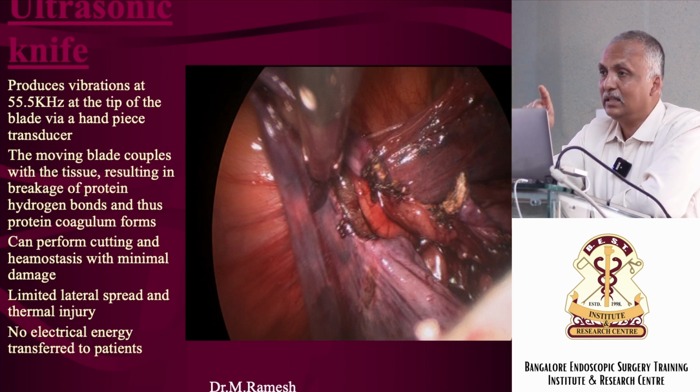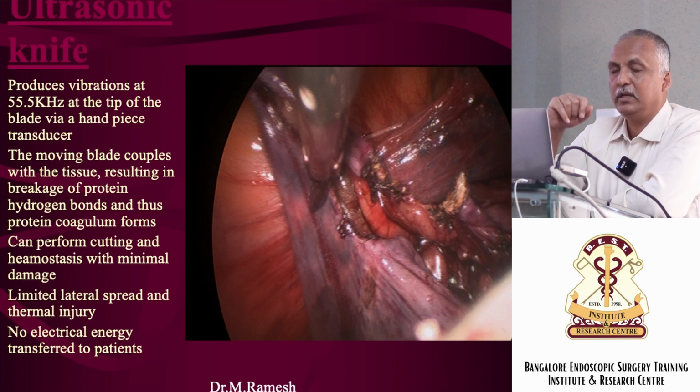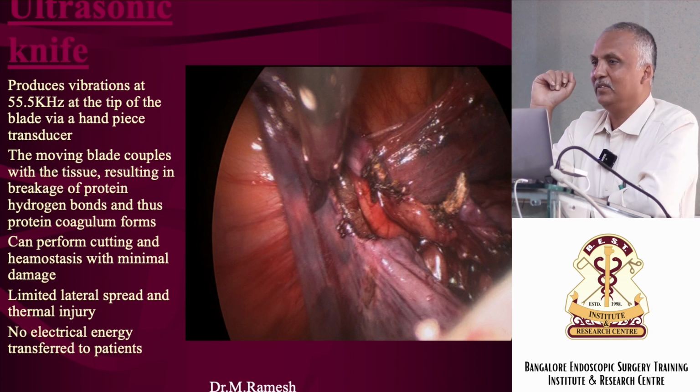But there is something called lateral thermal effect. When you are on a uterine artery, if you are very close, the ureter will get burnt. So you must be at least 1 centimeter away when you are using a bipolar. You can be just 1 millimeter away when you are using a harmonic.